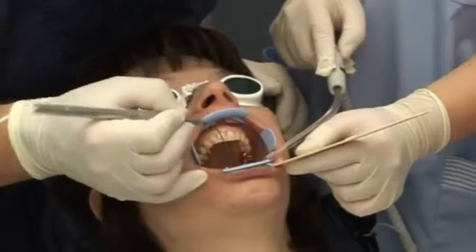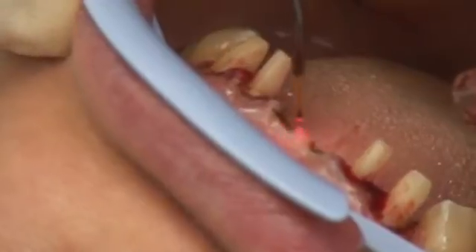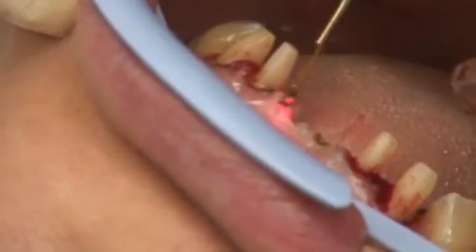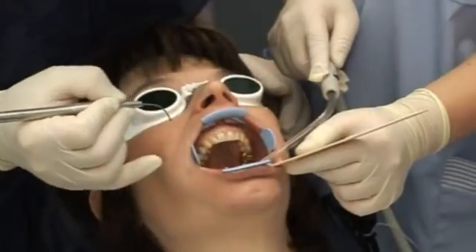After approximately 1 week, you will have optimal mucous membrane conditions. You can also remove inflamed tissue from the gingival sulcus in a single step, as you may find in comparable periodontal cases.